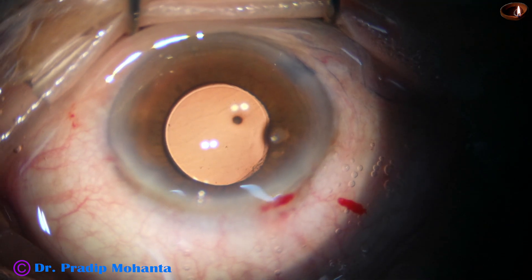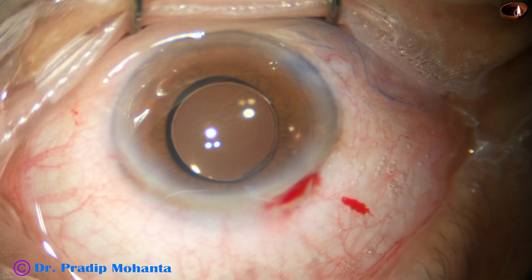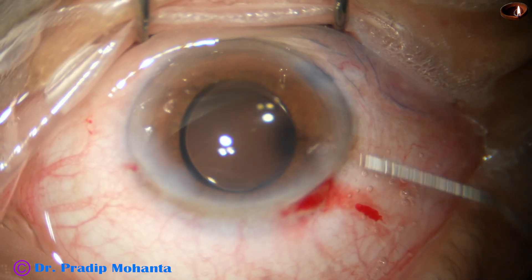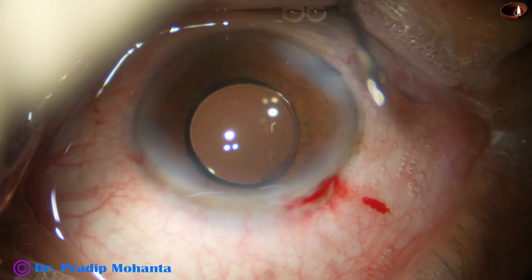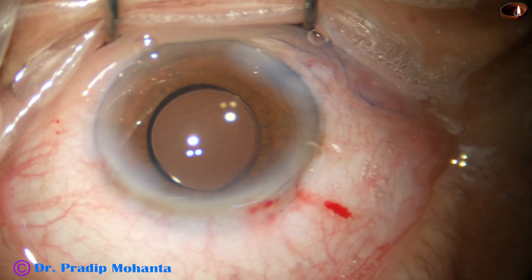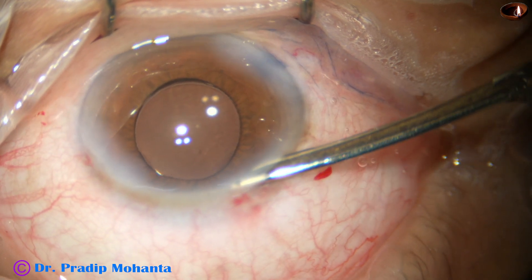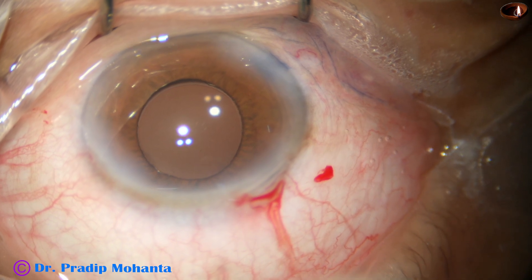And now this is a bit of moxifloxacin, then the side ports are closed by stromal hydration. We should inject fluid on the scleral side of the side port, not the corneal side — just as a precaution not to cause Descemet's membrane detachment. And now this is the final lavage of the anterior chamber. The anterior chamber is formed nicely, integrity of all the wounds are checked, and the case is concluded.